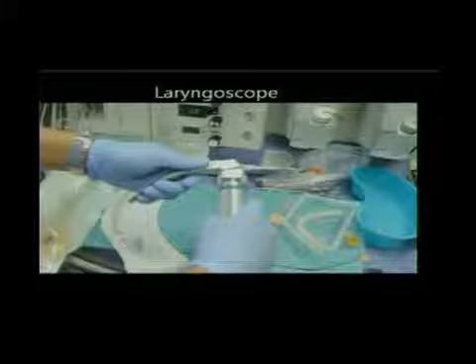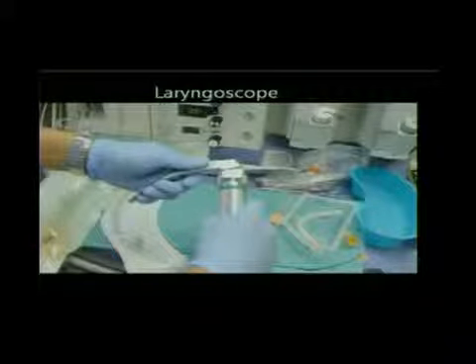And at this point, Professor Hung is evaluating that the laryngoscope, the blade and everything is working, but most importantly, that the light works. So he verifies that the light works.